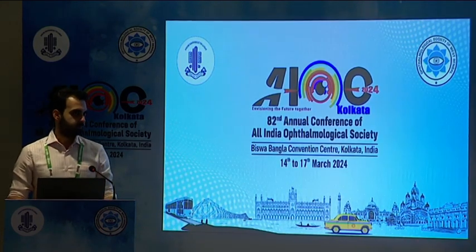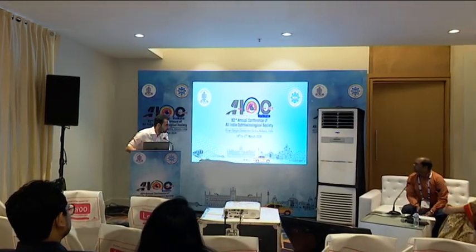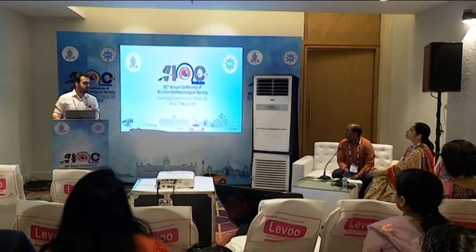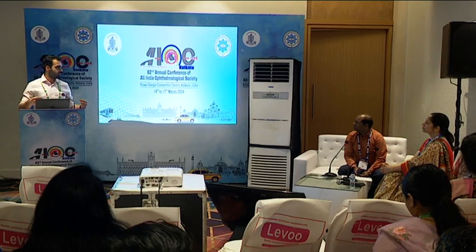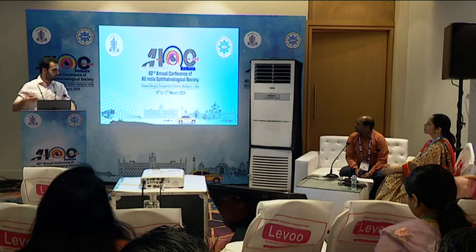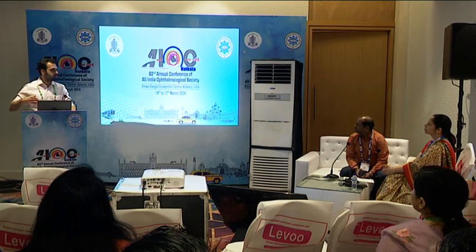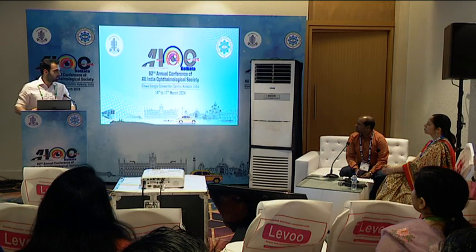How do you achieve centration? Sorry, sir. While using iris claw lens, how do you achieve centration? So centration is basically, what's important is that our two side ports should be exactly opposite each other, and I've seen that a lot of times people also avoid using the previously made side port, because the side port we usually use for the rexis and throughout the surgery has a slightly longer intracorneal length. So for the lens implantation, they suggest that make one with as short an intracorneal length as possible and exactly opposite to each other.